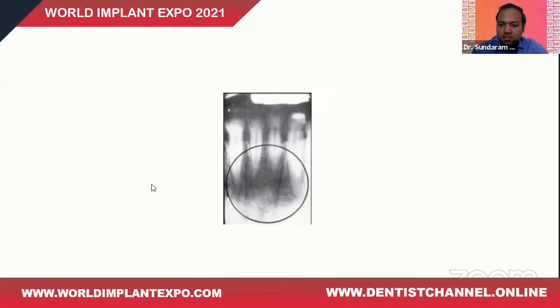Now, what is this structure? This is something known as a mental fossa that gives us a hazy appearance of radiolucency. It also gives us a vague impression of some form of periapical infection, which is actually not.